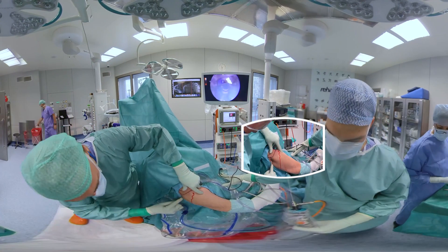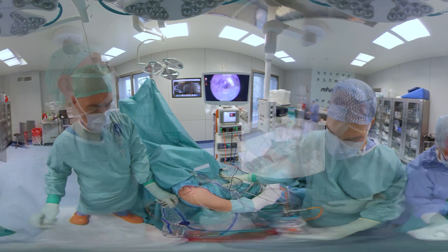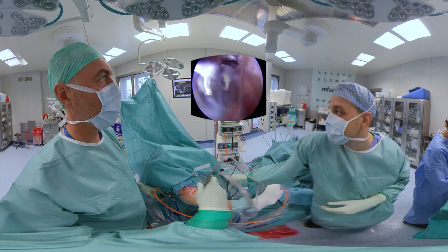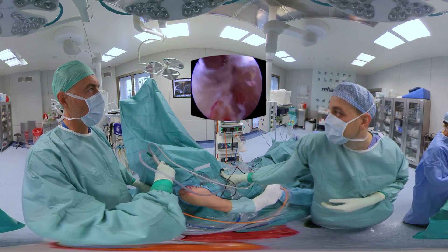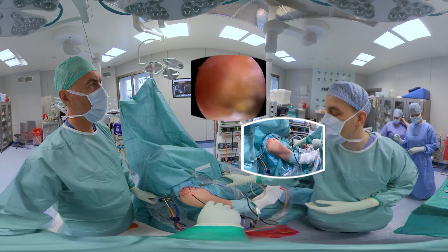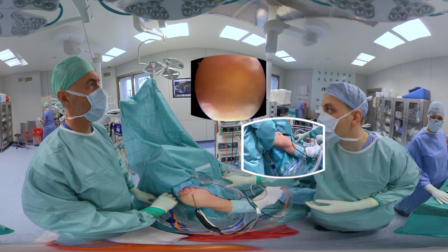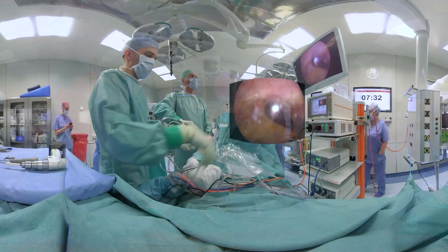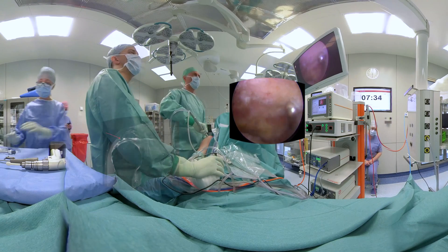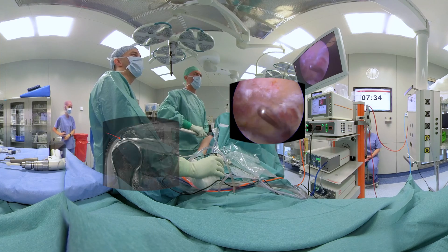Next, the scope is transferred into the subacromial space and bursectomy is performed. The area of the tear, the footprints, and the tendon have to be clearly exposed. Due to clinical, radiologic, and arthroscopic signs of impingement, anterolateral acromioplasty is performed. It also brings the additional benefit of increased working space.